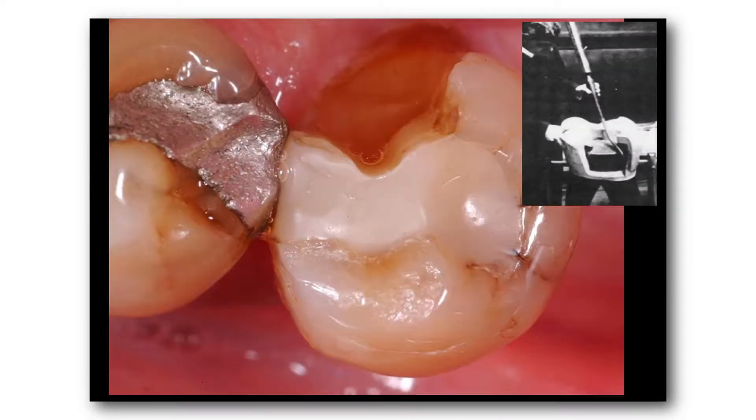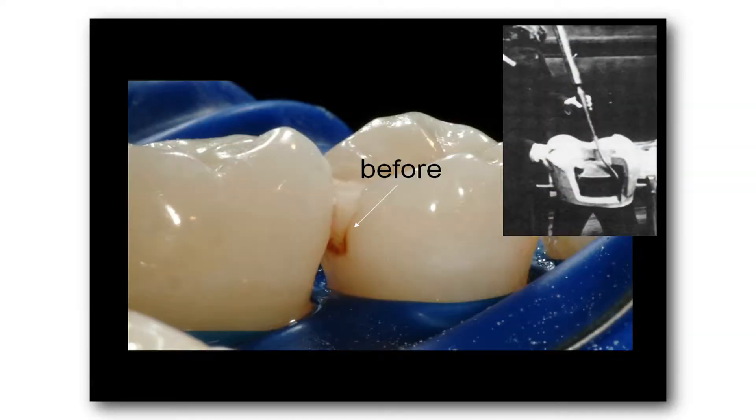Now, this next slide shows a tooth with a fracture in it that had a traditional G.V. Black cavity preparation. The composite resin was placed in the tooth, and within just a few years, the lingual cusp broke off the tooth. So once again, these cavity preparations predispose the tooth to fracturing, and composite resin materials do not prevent tooth fracturing. The only way we're going to stop tooth fracturing is to change the prep to something that damages the tooth less.